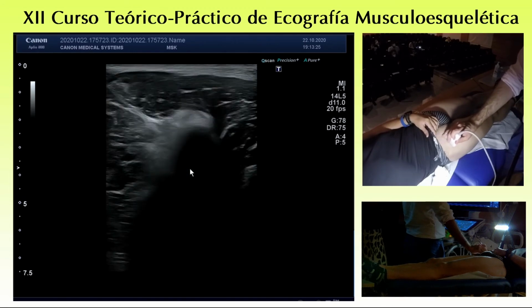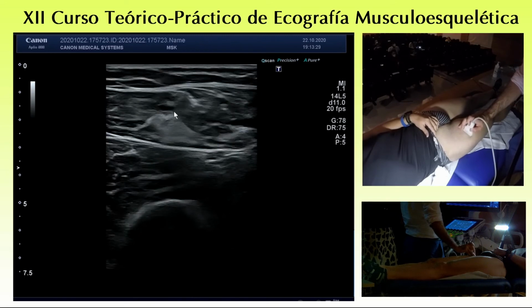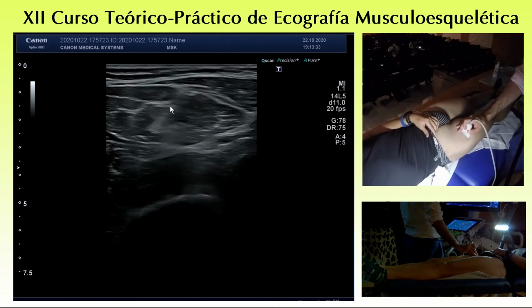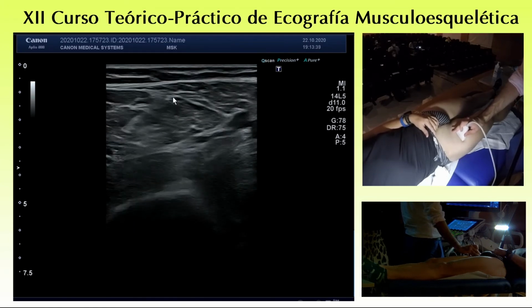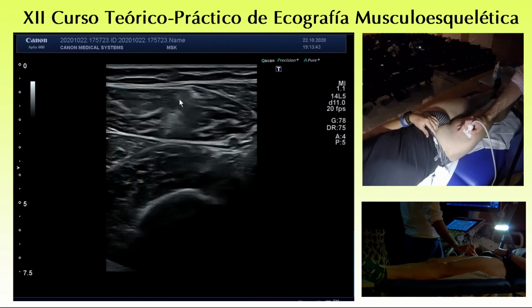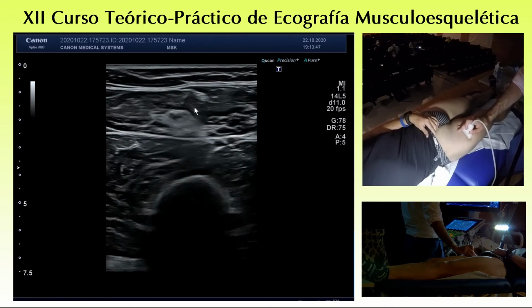Okay. So rectus femoris indeed has more than one myotendinous junction, because it's described as the indirect tendon. This is the point, the intermuscular aponeurosis, and this is itself a myotendinous junction, but only for the indirect part.